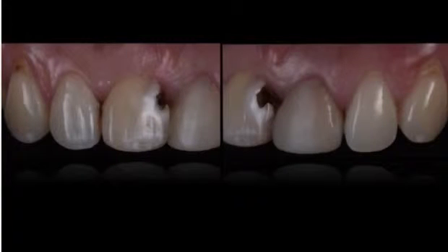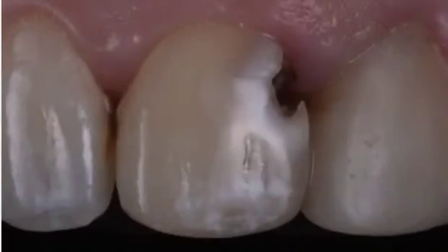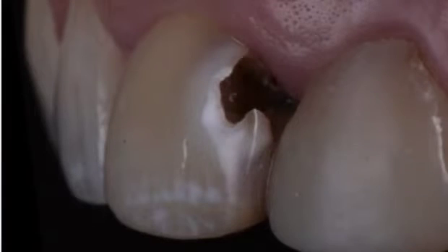Pictures from different sides. Also, there are caries decays on the lateral incisors. Now you can see this. And the close look to this, I call this a black hole. It's a joke for sure, but this is a caries decay that gives us a lot of problems during the preparation, during the isolation, and during the restoration. You will see the case step by step.